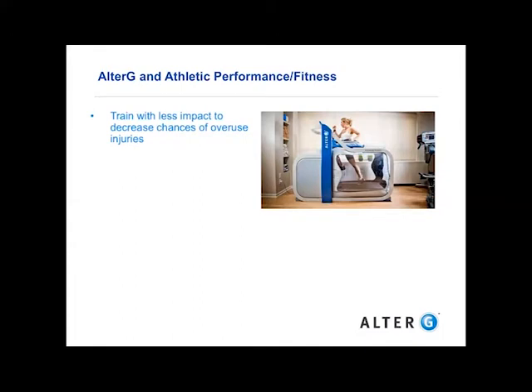So for aerobic conditioning, they can train in the AlterG with less impact to decrease the chance of overuse injuries. Especially for athletes training for half marathons and marathons, there's a lot of volume involved. So the last thing you want is, when it gets close to race day, to develop some type of injury that's going to hamper the race or even cause them to miss it. So by training in the AlterG 1 day a week at 90% body weight, 80% body weight, you can still get cardiovascular conditioning, but there's less impact and less likelihood that you could develop an overuse injury.